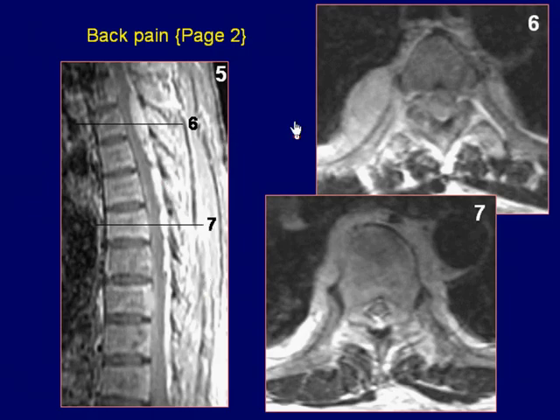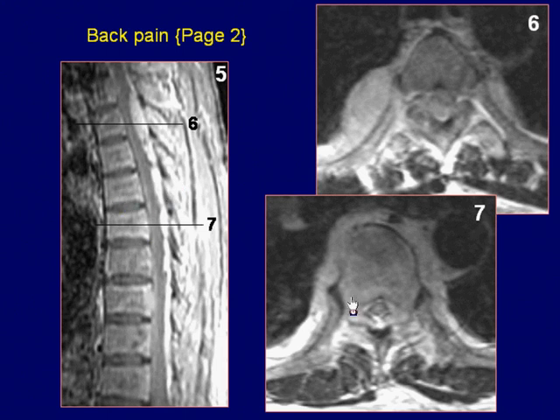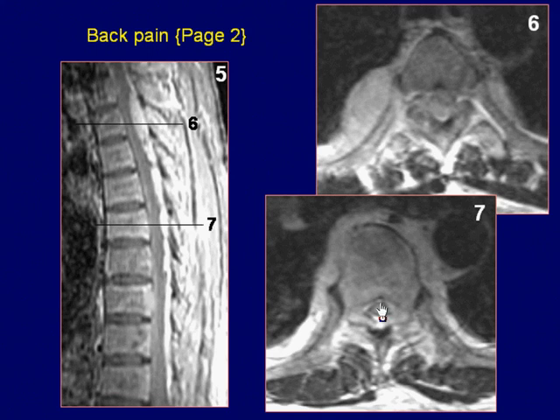These are sagittal and axial post-GAD fat saturation T1-weighted images of the thoracic spine, demonstrating abnormal paraspinal enhancing mass lesions associated with abnormal marrow lesions and epidural mass.